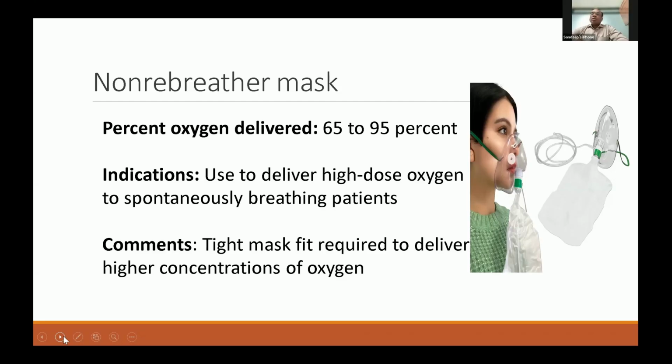All the air that the patient is breathing is through this reservoir bag, which is full of 100% oxygen. So if you are using it properly, you can deliver near to 90 to 95% of FiO2 through these devices. So these devices are used in patients where the need of oxygen is very high. Most of the times in viral pneumonias, bacterial pneumonias, where rest of the things are okay, but the oxygen requirement is very high.